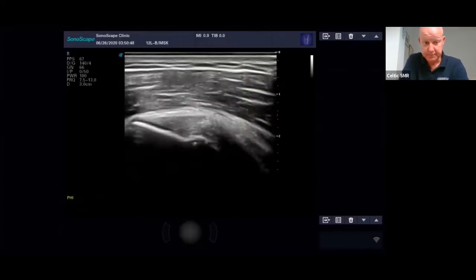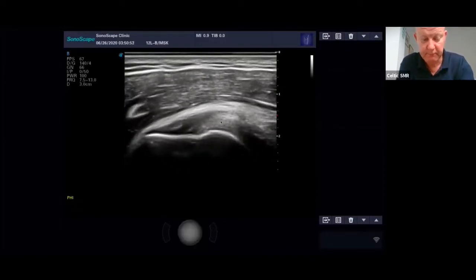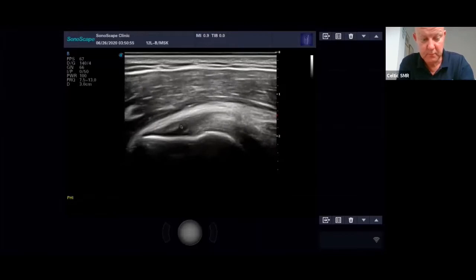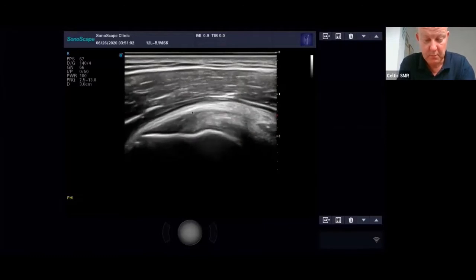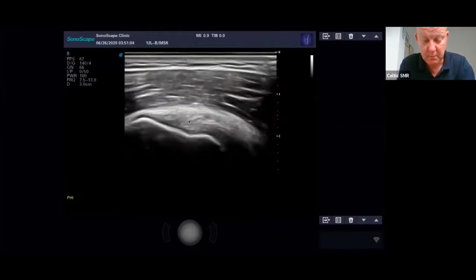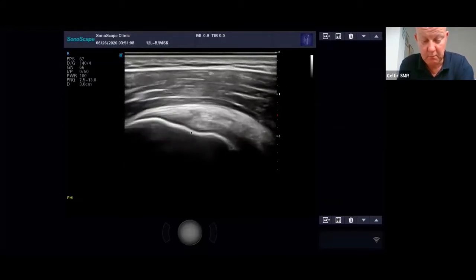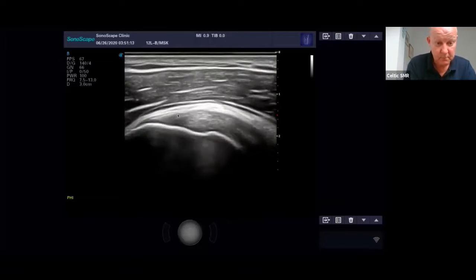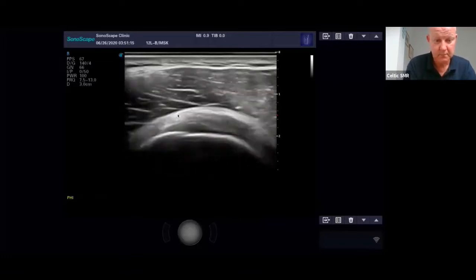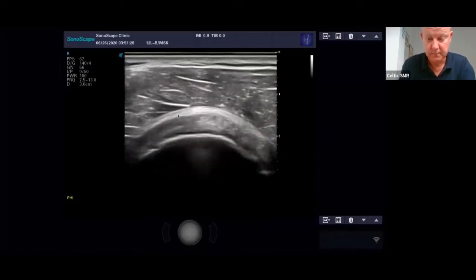Very nice. And if I angle up, do you see how that goes dark here? That's not tendinopathy, that's just my beam. These fibers are going down this way and the beam's coming straight down, so I need to angle so the beam hits those fibers at 90 degrees, and then they'll all fill in and look nice. Then again, hold the probe and turn transverse, and you're back on your transverse section.